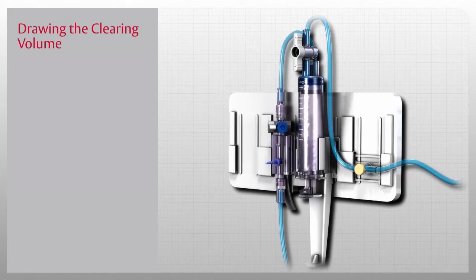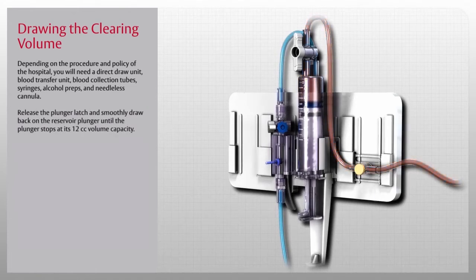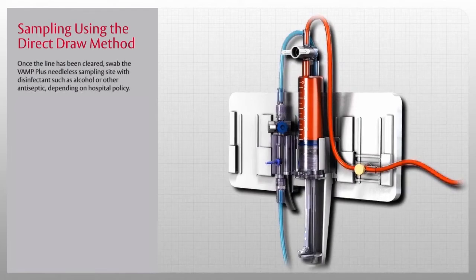You are now ready to use the VAMP Plus system for blood sampling. Depending on the procedure and hospital policy, you will need a direct draw unit, blood transfer unit, blood collection tubes, syringes, alcohol preps, and needleless cannula. Release the plunger latch and smoothly draw back on the reservoir plunger until it stops at its 12cc volume capacity — the recommended draw rate is one second for each cc. When the volume has been drawn, close the shutoff valve by turning the handle perpendicular to the tubing. Once the line has been cleared, swab the VAMP Plus needleless sampling site with disinfectant such as alcohol or other antiseptic depending on hospital policy.